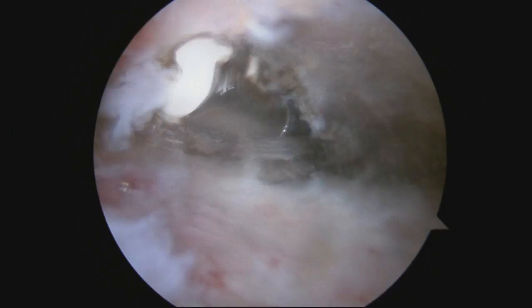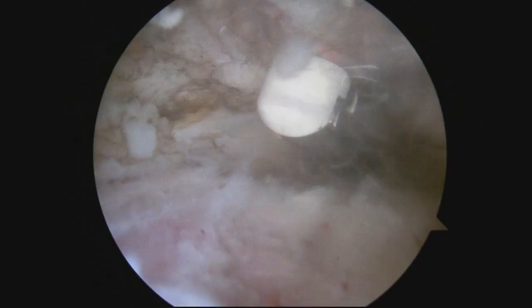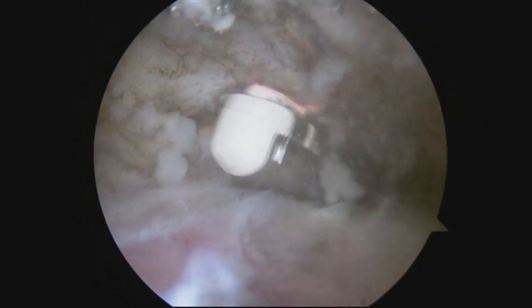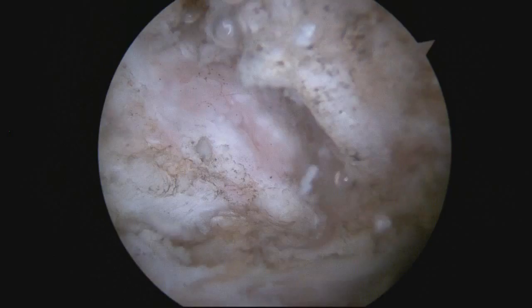We're viewing the shoulder in the subacromial space just below the AC joint, using the radiofrequency device to clean out the soft tissue and expose the AC joint — that gap between the two bones that you see there.